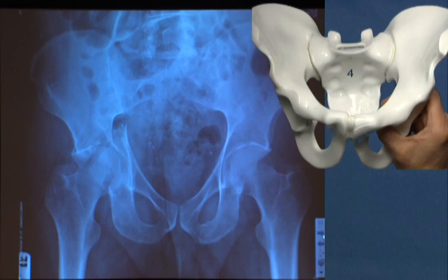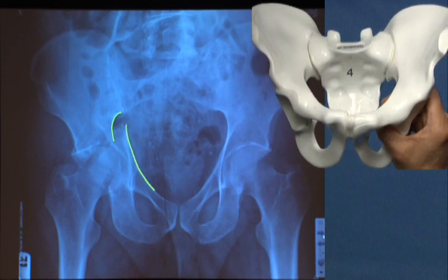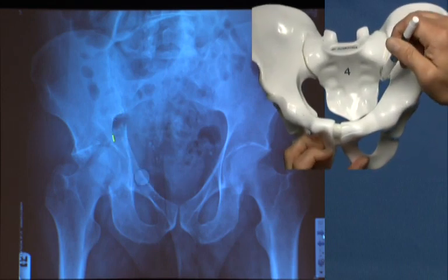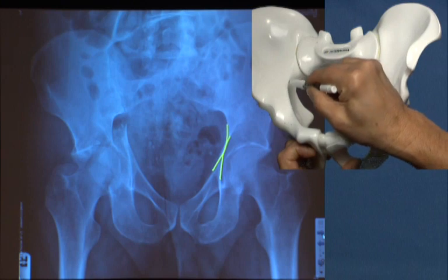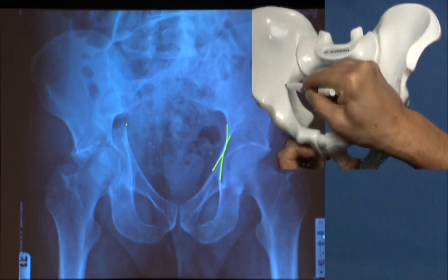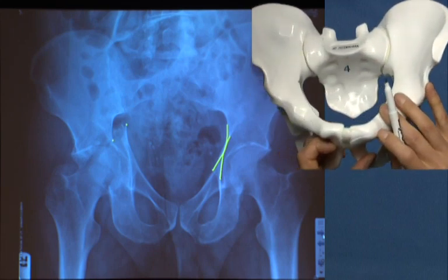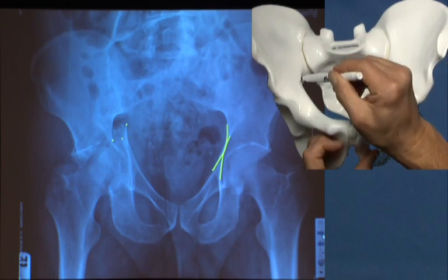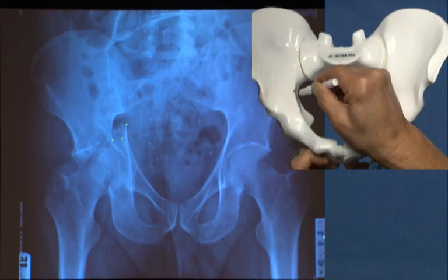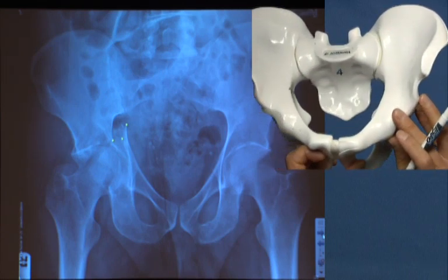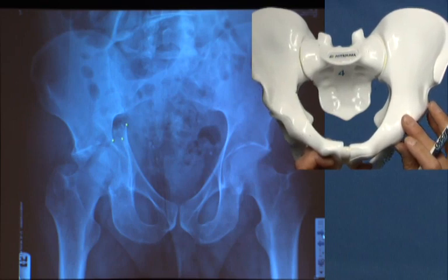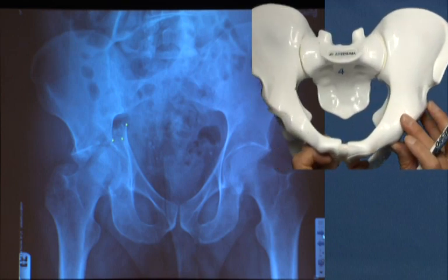The first one is the iliopectineal line. As I trace the iliopectineal line up on the injured side, I can clearly see a disruption occurring above the confluence of the iliopectineal and ilio-ischial lines. Those lines have a confluence that overlap at about this level, so I can see a disruption of the pelvic brim above that point of confluence and draw that point on the pelvic brim. As I rotate this back to simulate an AP pelvis, we're going to have a disruption going back to the greater sciatic notch, crossing this area of the sciatic buttress — giving that very clean appearing disruption of both lines at the same location.